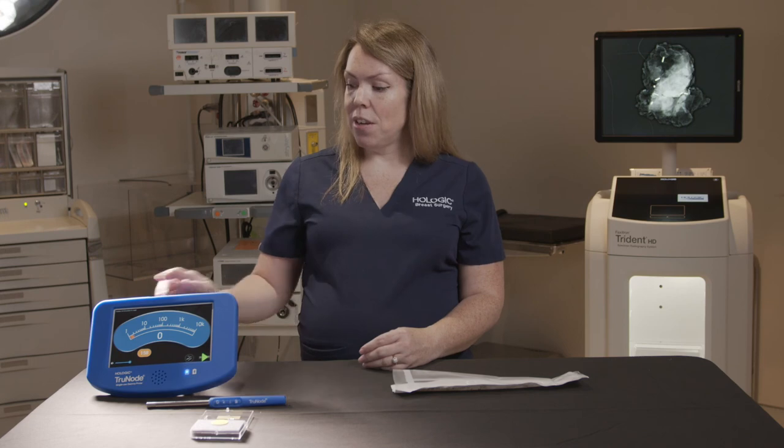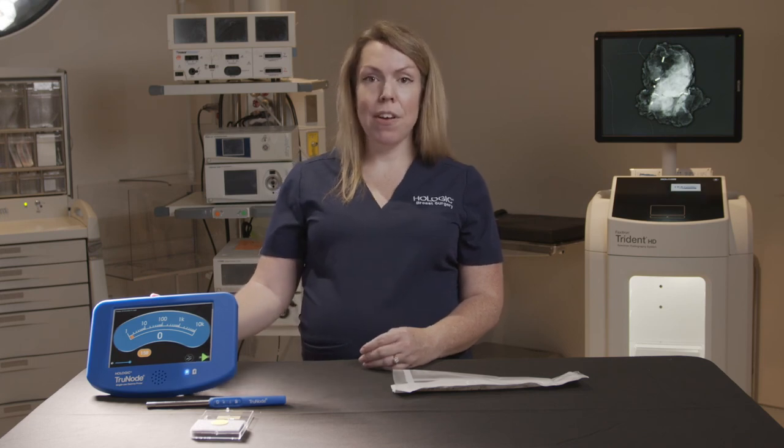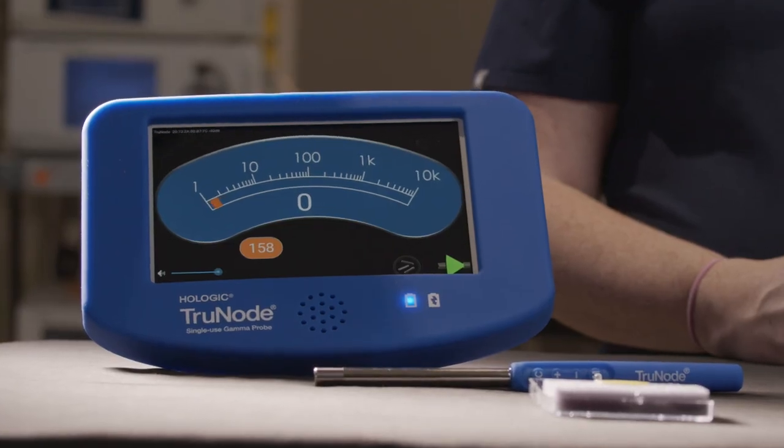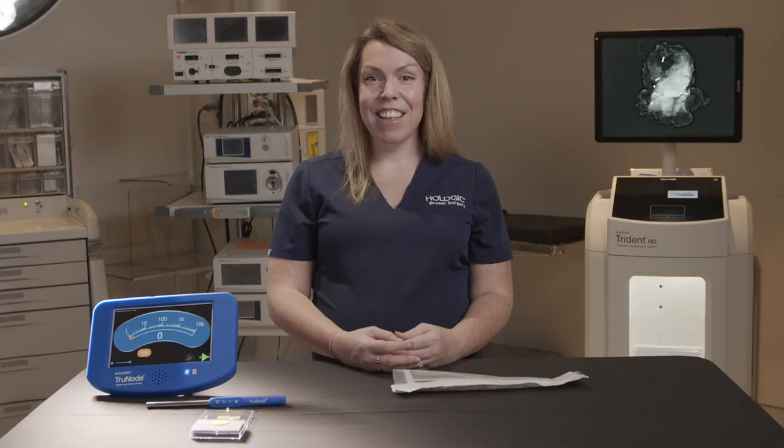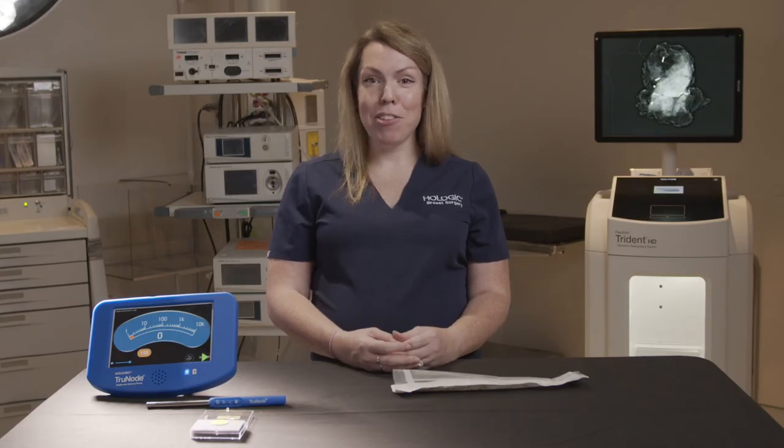At the end of the case, the tablet should be turned off and then turned back on again before the start of the next procedure to pair a fresh probe with the tablet. Thank you so much for watching and learning about the TruNode Gamma Probe.